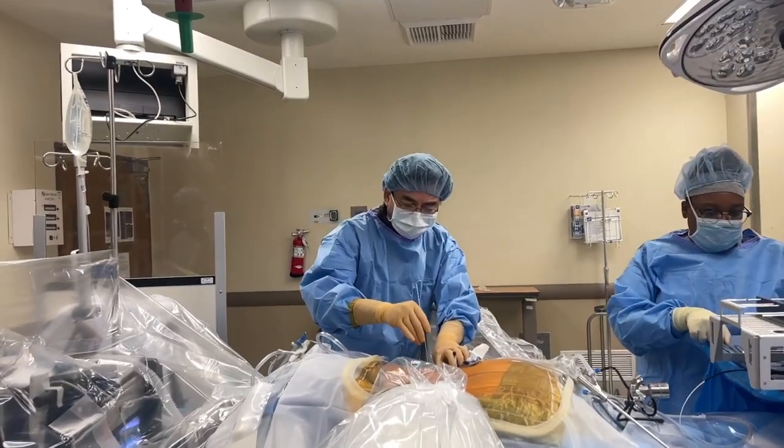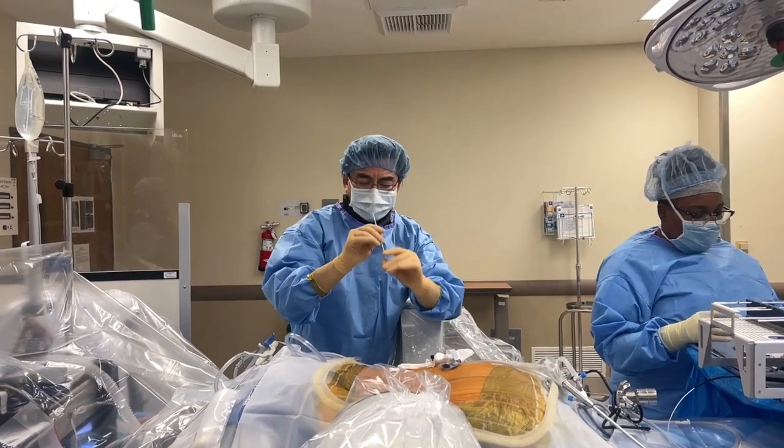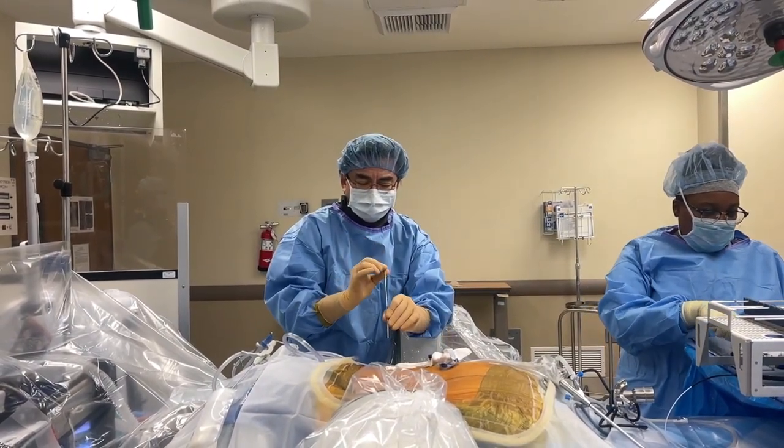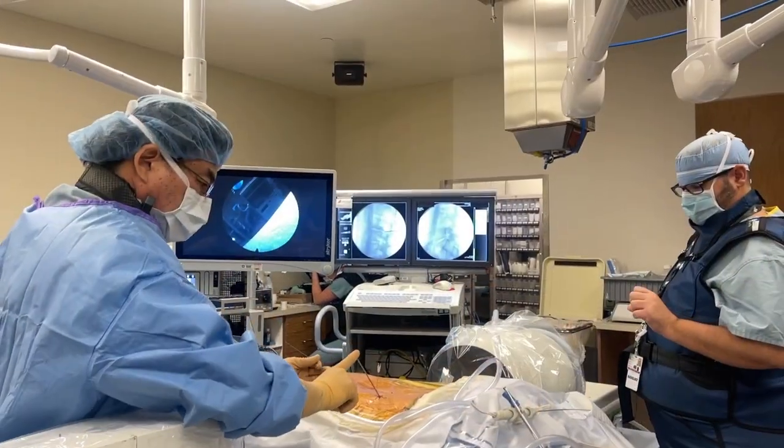It's so adorable. Now I'm gonna use the spaghetti noodle dilator. Look how skinny it is, like the inside of a big pen. Once I get this perfectly, I'll put a straw over this and a slightly bigger dilator and a bigger one, and slowly dilate up. Okay, I've got the spaghetti noodle dilator down.